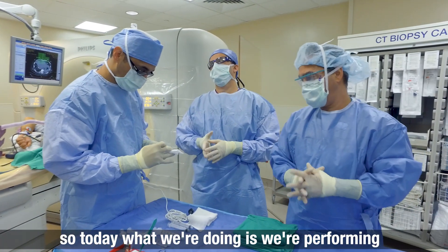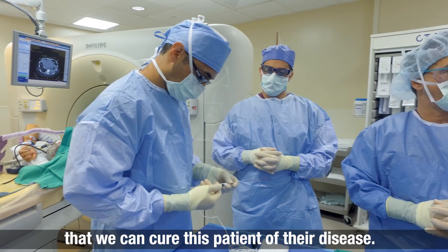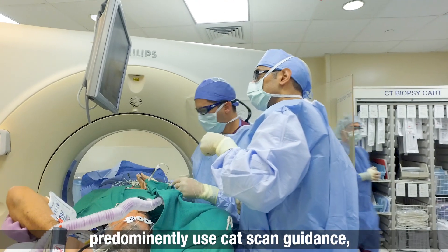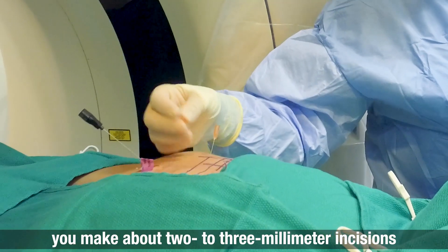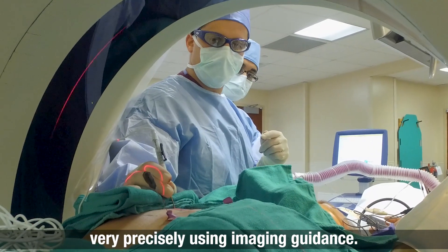Today we are performing NanoKnife of this residual tumor with the hope that we can cure this patient of their disease. When we perform these procedures with imaging guidance, we predominantly use CAT scan guidance. We make about two to three millimeter incisions on the patient's skin and place needles very precisely using imaging guidance.